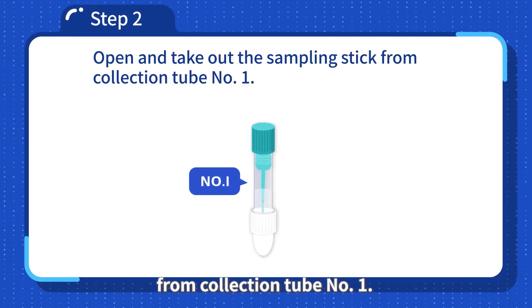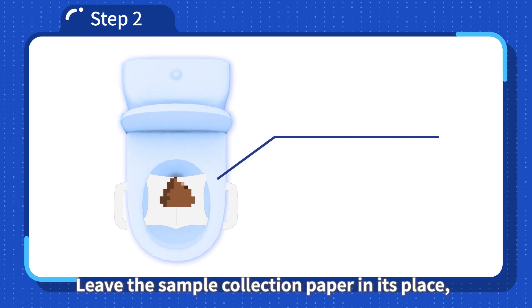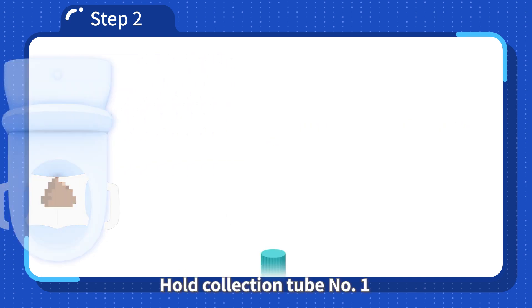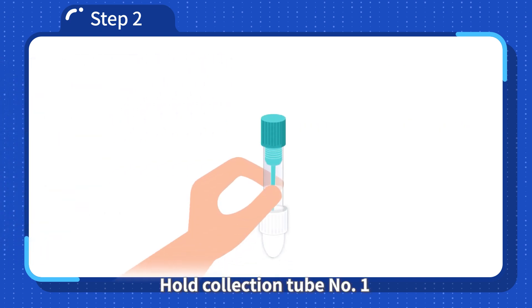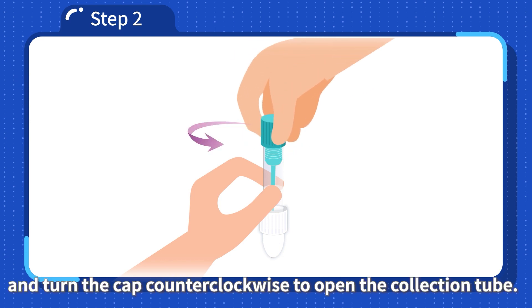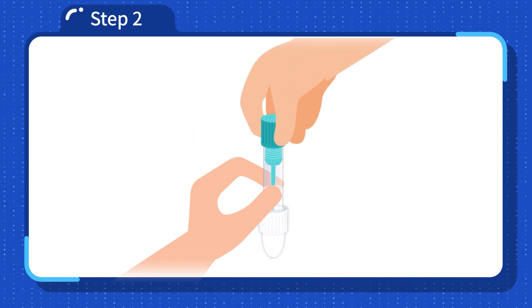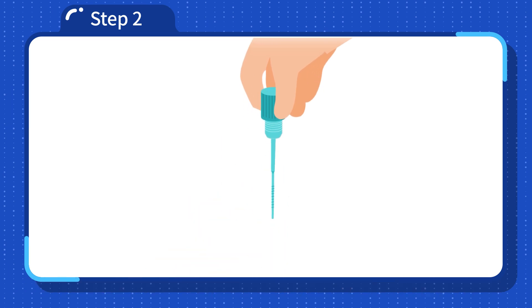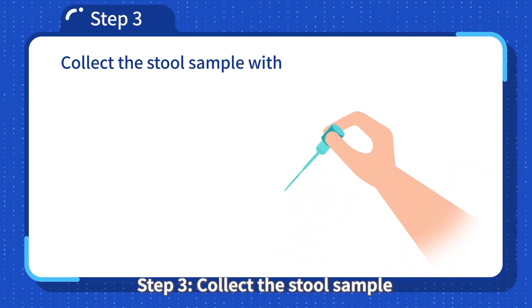Step 2: Open and take out the sampling stick from collection tube number 1. Leave the sample collection paper in its place — do not lift the toilet seat. Hold collection tube number 1 with the blue flat cap facing up, and turn the cap counterclockwise to open the collection tube. Take the attached sampling stick out of the collection tube.